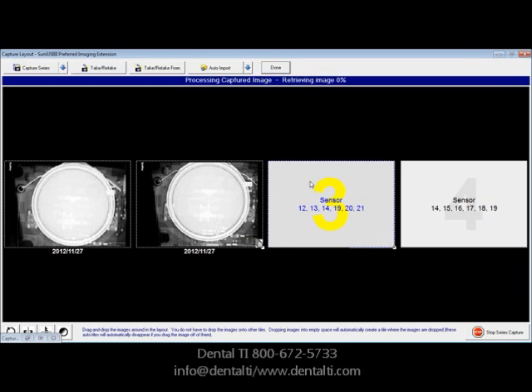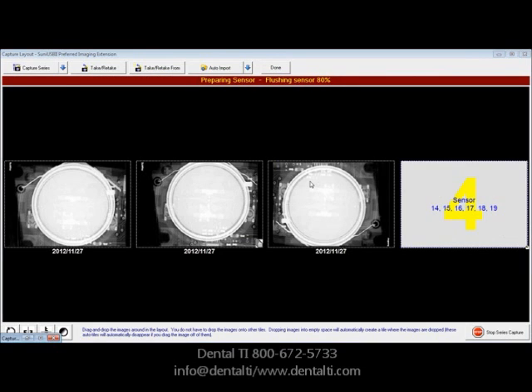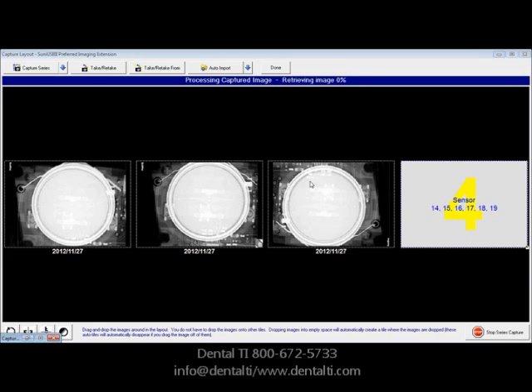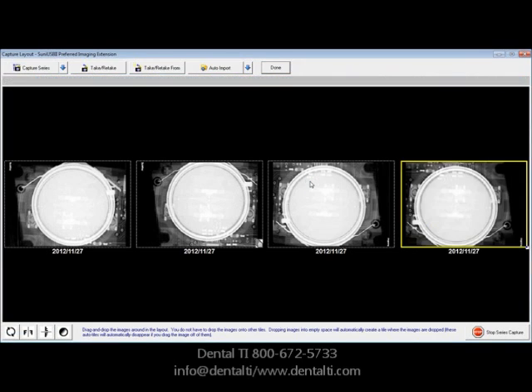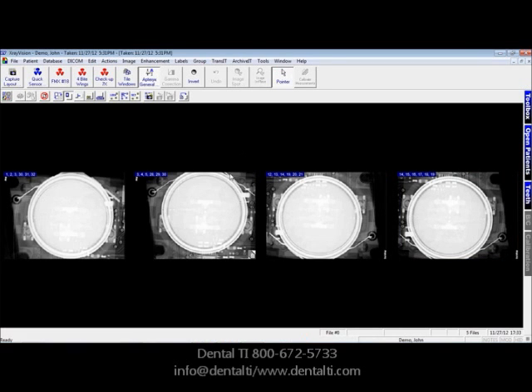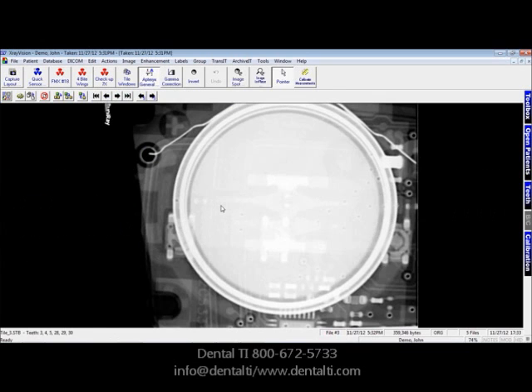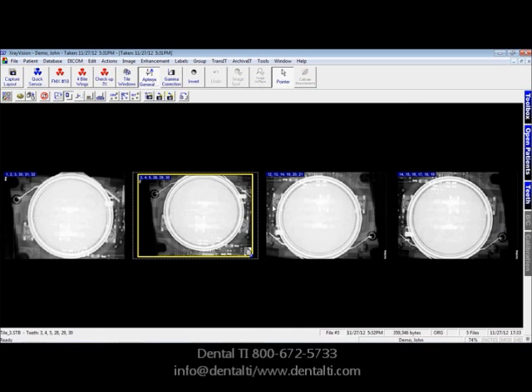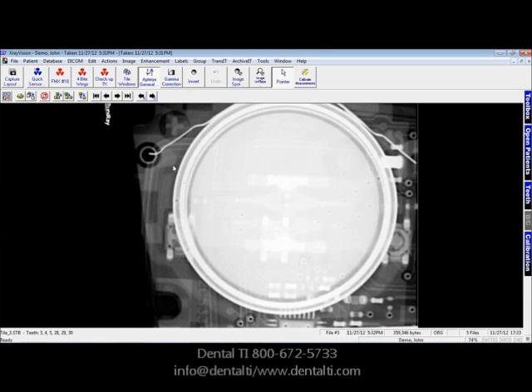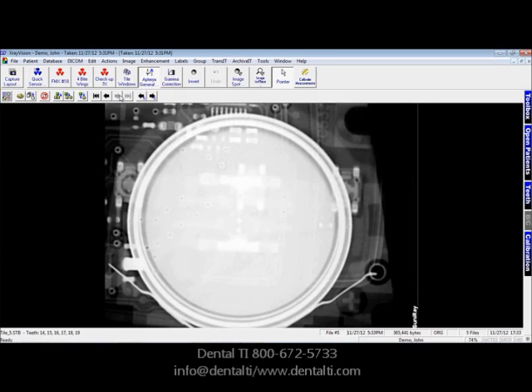Here we could expose position three — the patient's left side. You'll notice the image is flipped so it will be oriented properly for the left side. Now we'll go ahead and take the fourth and final image. When all images are in the layout, you can click Done, and then you're at the desktop, ready to double-click on an image to see it full screen, double-click to see the layout view, or double-click and advance from one image to the next.